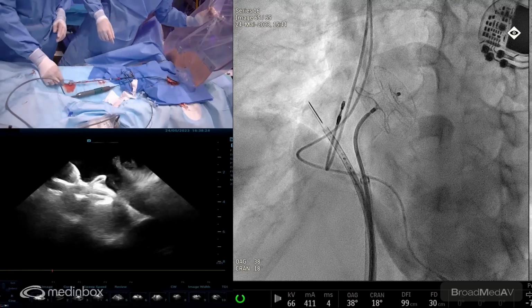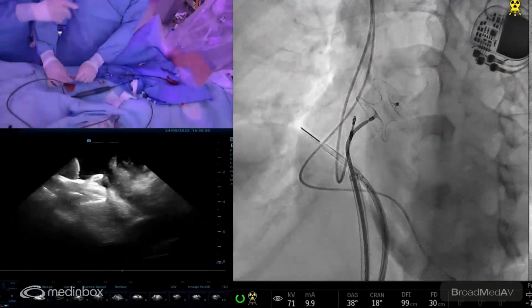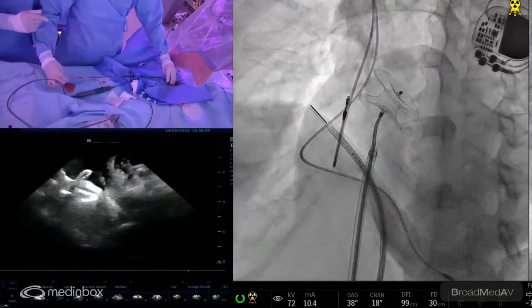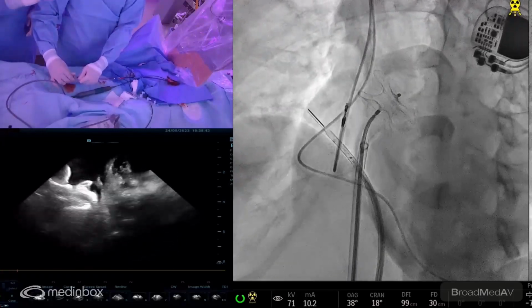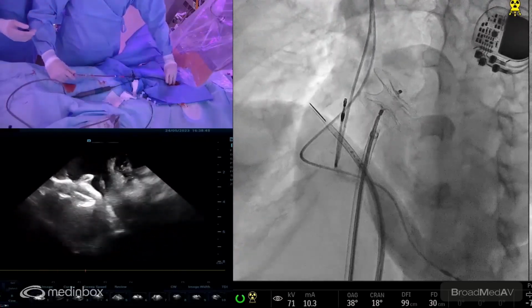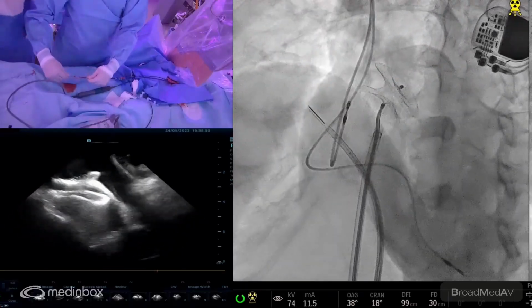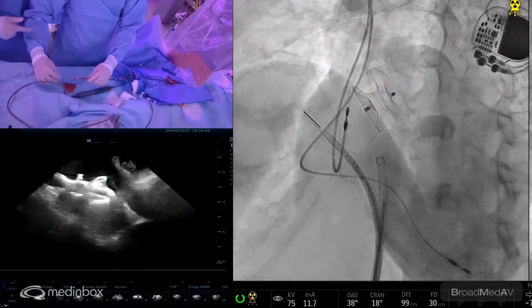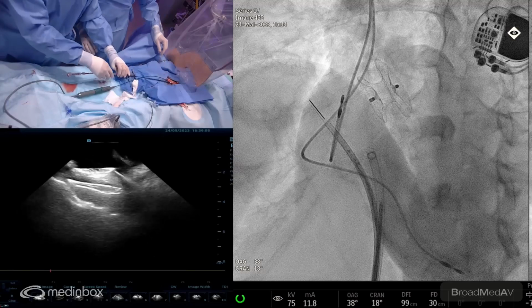Yeah, sure. Okay. Typically, we have a pin that I lost on the floor. No problem. You will be able to detach. I always approach a bit with the sheath just to not have so much tension at the moment of the deployment, something like that. I try to be at the same axis. You will turn the little sheath towards the device to minimize the tension. Something like that. And then when you're in line, you will turn counterclockwise the cable to detach the device. Right. Okay. And now the device is released, nicely placed. It didn't move a bit.